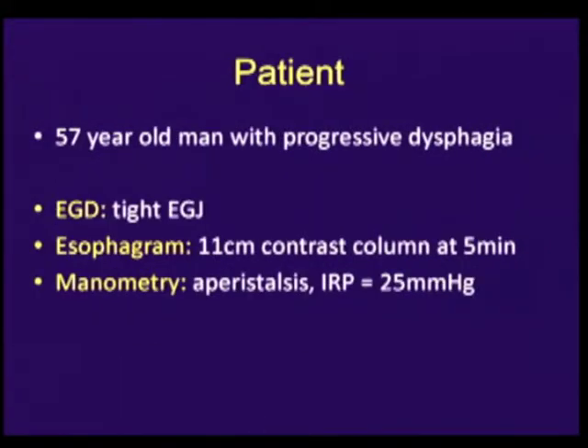This video shows a POEM procedure in a 57-year-old man who presented with three years of progressive dysphagia and regurgitation. Manometry showed aperistalsis and a failure of EGJ relaxation, and esophagram and EGD were consistent with achalasia as well.